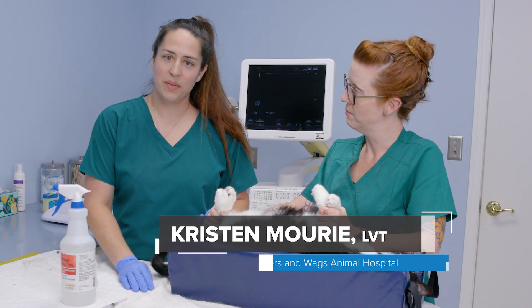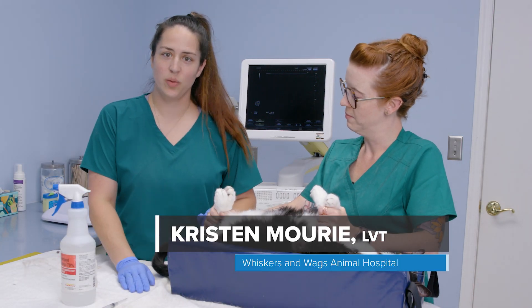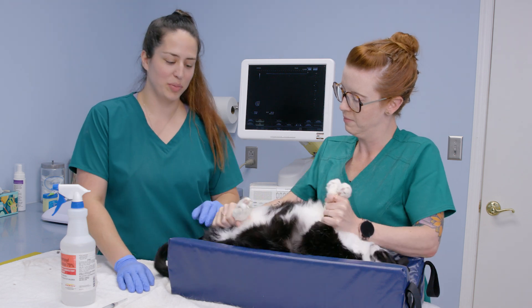We're going to be talking about how to collect urine by cystocentesis today. We'll be using an ultrasound to help guide our needle into the bladder.